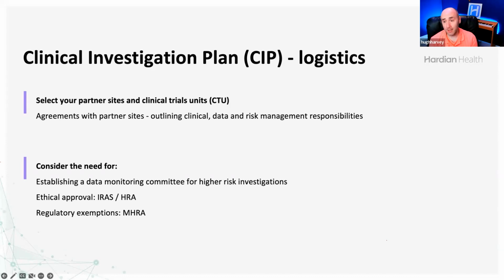You need to document exactly what clinical data points you are and aren't collecting, what data you are storing, how long for, what the data destruction processes are, the anonymization protocols, and who is responsible for risk management. And those of you who are GCP trained will be familiar with all of this terminology. This is also outlined in the ISO standard 14155 that I mentioned.